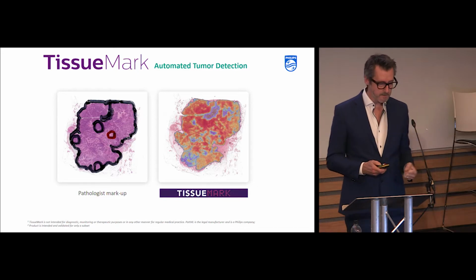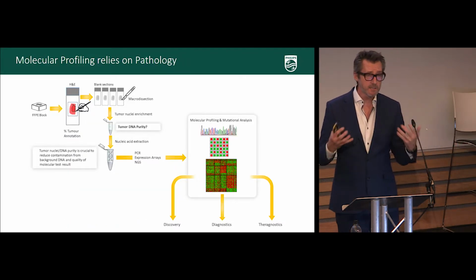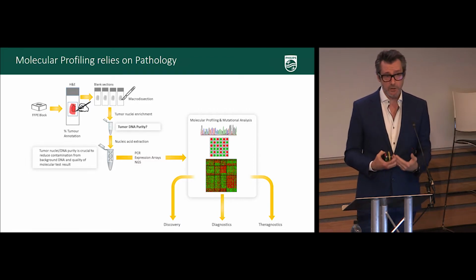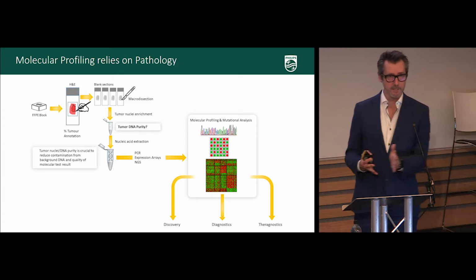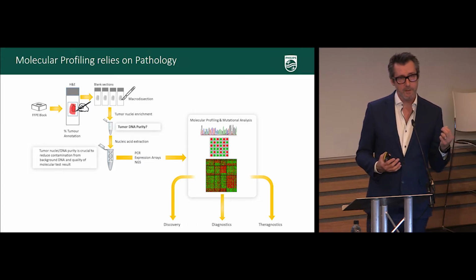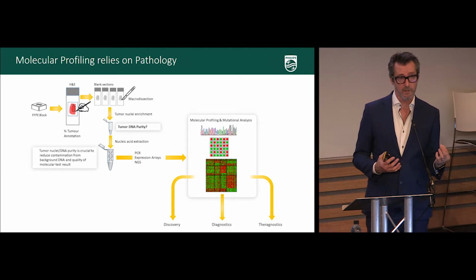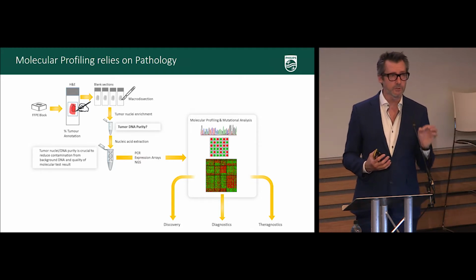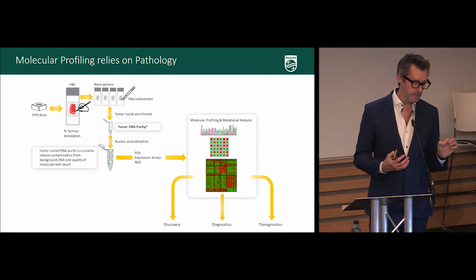In molecular labs, where techniques such as next-generation sequencing and molecular profiling in solid tumors are used, the starting point is absolutely critical to the success of those technologies. That starting point is pathology, reviewing the H&E tissue sample to determine where in that sample the tumor exists, to annotate that for macrodissection, but also to precisely estimate the percentage of tumor cells within that sample.